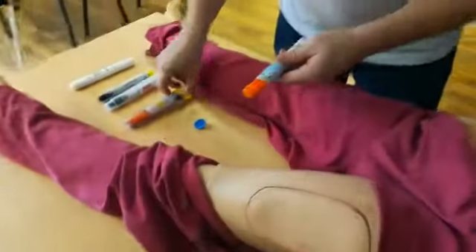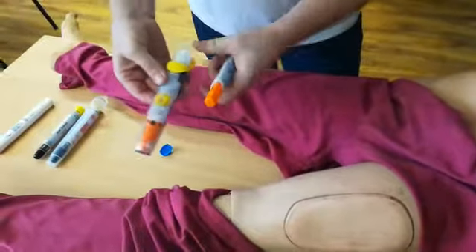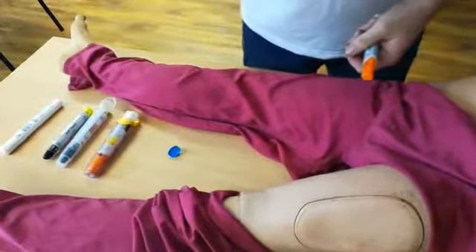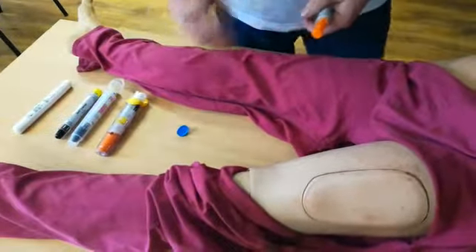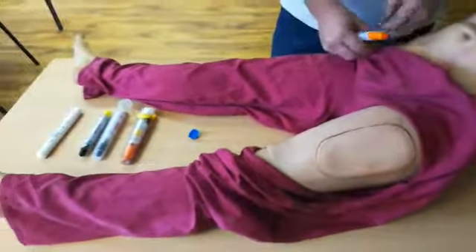Keep an eye on the patient's vital signs, and then put the pen safely away. If the person has another EpiPen, we can use it after a further 5 minutes if the patient's condition is not getting any better.